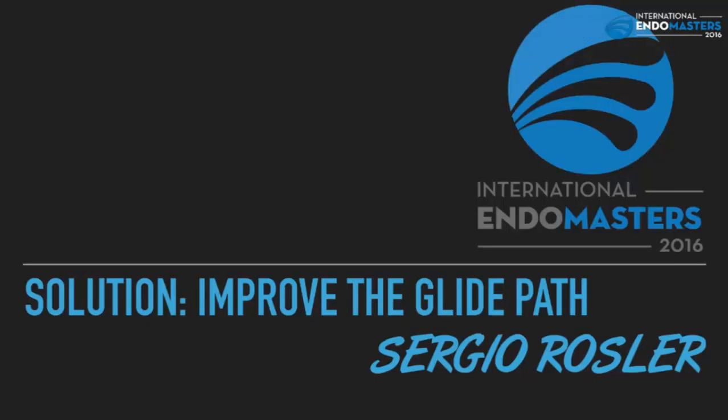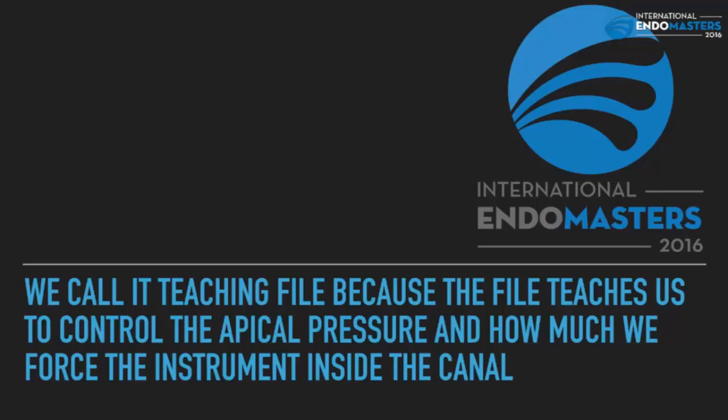This is another example and how it looks. The solution for this problem is to improve the glide path, as my friend Sergio Rosler from Buenos Aires, Argentina said. We call it the teaching file because the file teaches us to control the apical pressure and how much we force the instrument inside the canal.